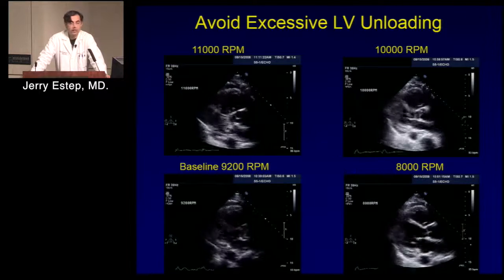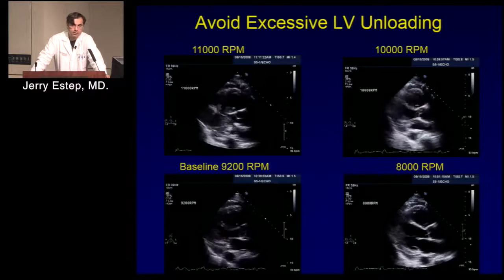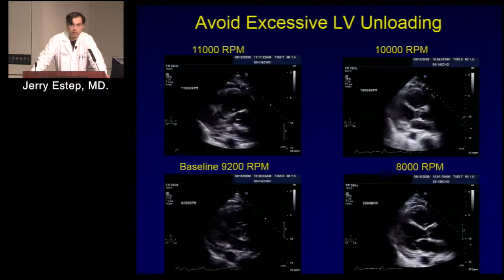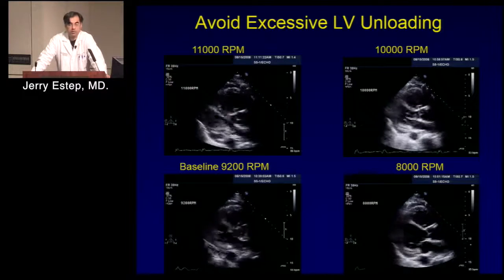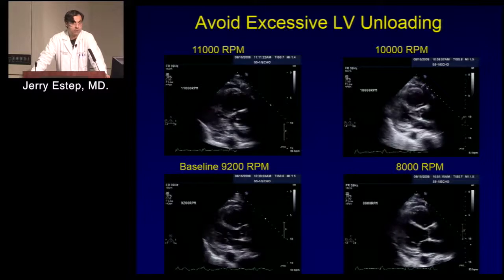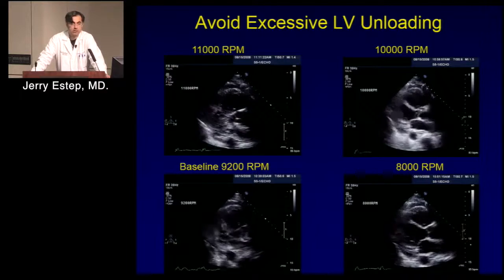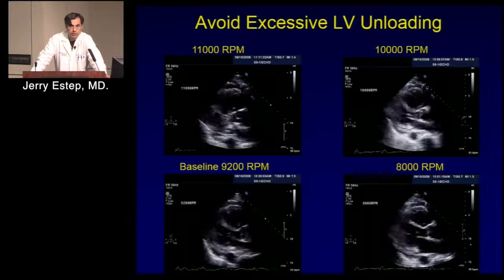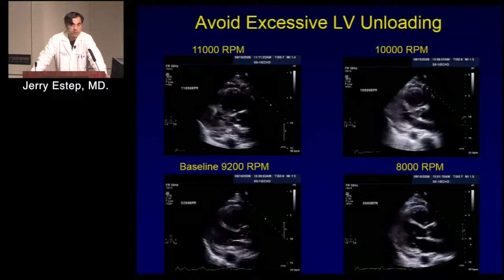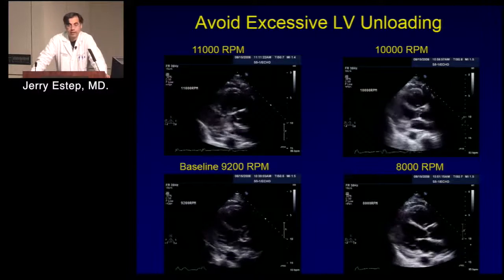But if you don't see, and we typically see, we've quantitated it in an absolute way. So let's say I give you 100 patients and we went from low speed to high speed. We typically see 0.6 centimeter reduction in LV size as a cohort. That translates into about a 20% reduction in LV size from high to low. In those with the pump not working, specifically due to rotor thrombus, it's blunted. We don't see LV size change. We don't see aortic valve changes.